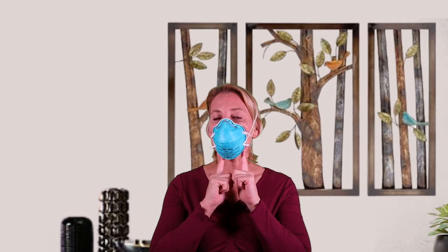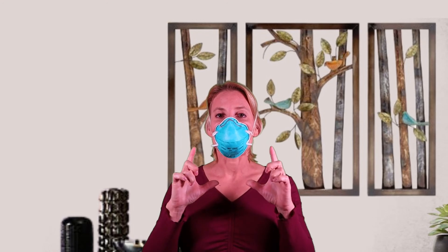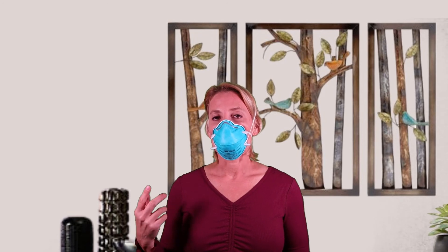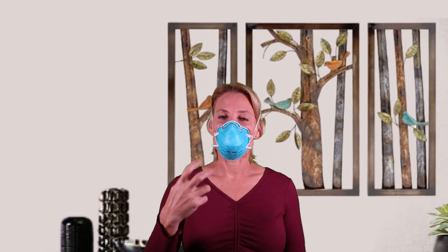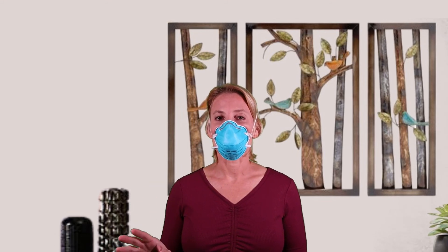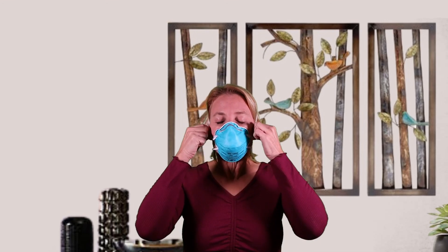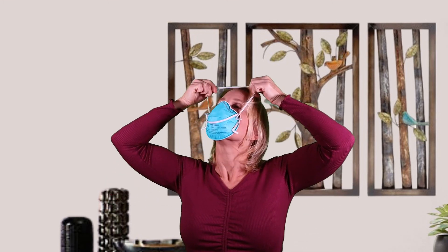This mask specifically is a small — I have a small face. This mask also comes in a regular size, and I have tried fit testing for that. When I try the regular size I can actually feel air coming out through the nose; even though I pinch it, it still comes out, and when I do the bitter test I can taste it. So that's a fail — I don't fit in a regular circular 3M mask; I have to have a small. When you take it off, take it off by the strings, don't touch the outside of the mask, and then throw it away.